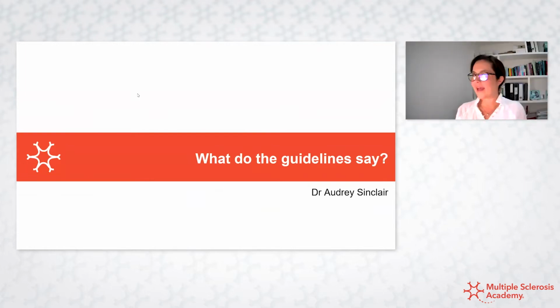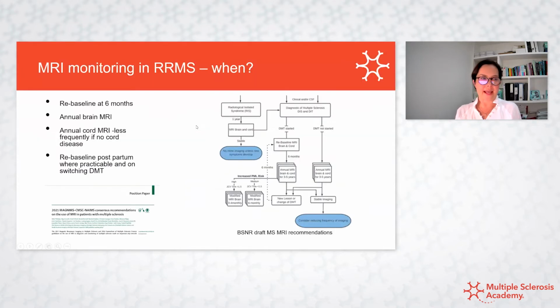Thank you, Wallace. So yeah, the guidelines have been in development for quite a while, and they've been really needed because I think most people who take part in an MS MDT or work in MS will know that there's such a huge variation in how patients are scanned and how difficult it is when we're coming to compare scans from one hospital to another, how management decisions can be delayed.